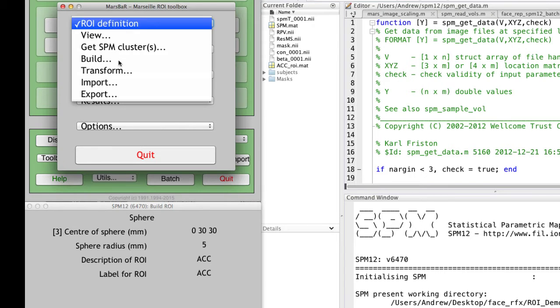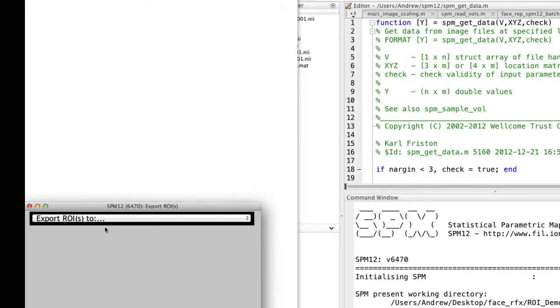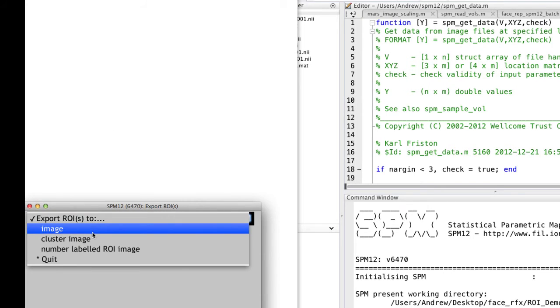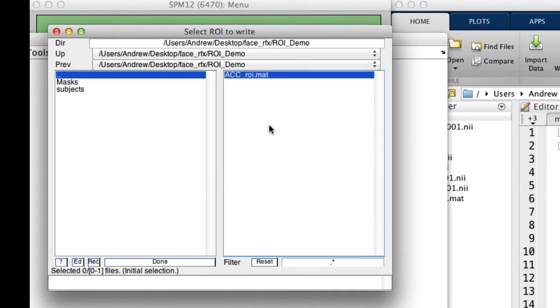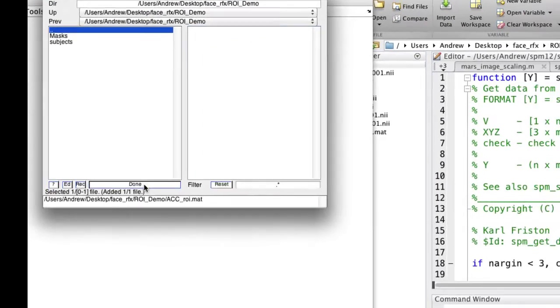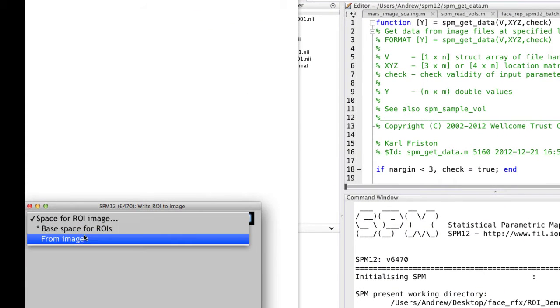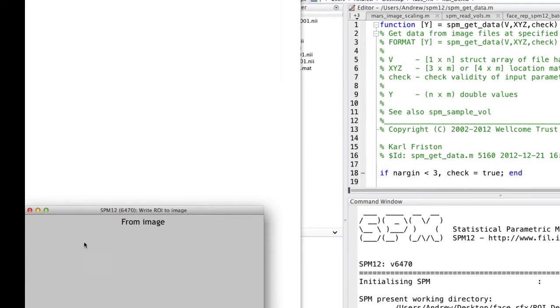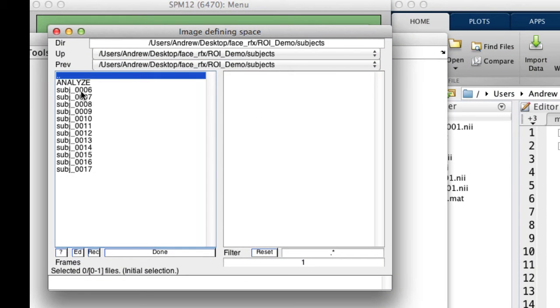Next, click on ROI definition, export, and export ROIs to image. We'll then select that ROI.mat image we created before, and then select space for ROI image. Select from image, and then go to your subject's directory.